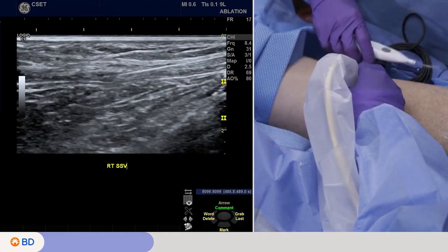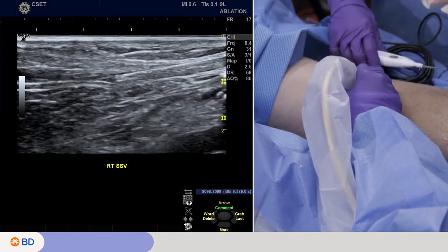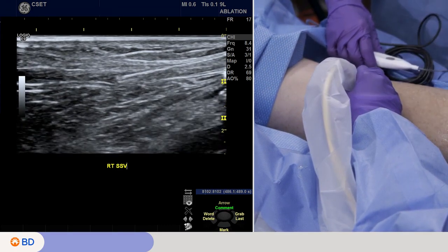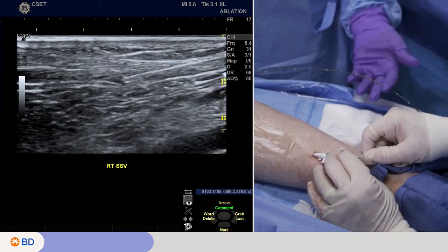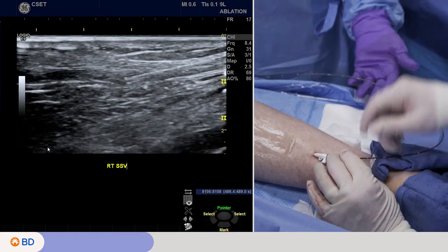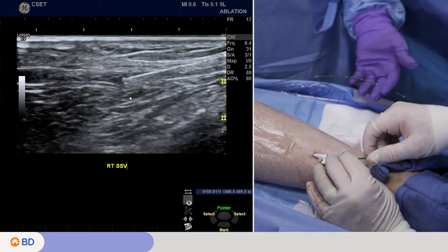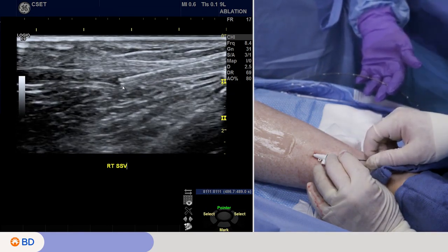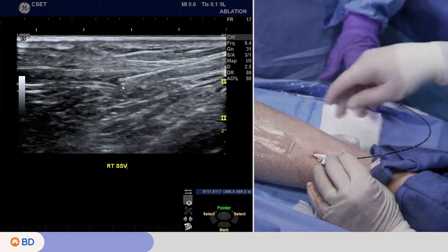So Casey has positioned the ultrasound right at the mid-popliteal space. We know that our termination is probably a deep vein, the femoral vein where it's going down. And so we're bringing this back, and we want to demonstrate now on ultrasound that we know exactly where the sheath, where the device tip is. This is a very nice demonstration on ultrasound where you'll see the linear echo density. You can actually see portions of the coil. There's the tip, with that extra density there. We know that's the tip.